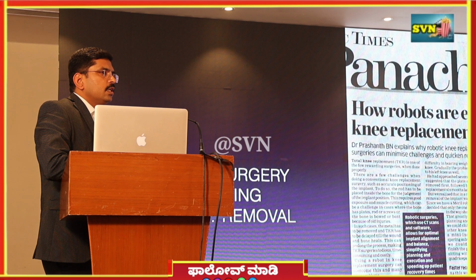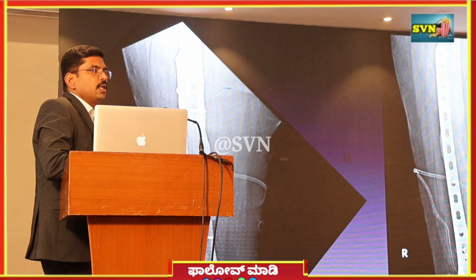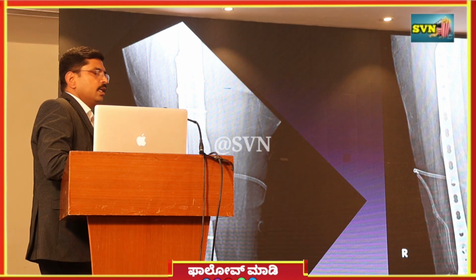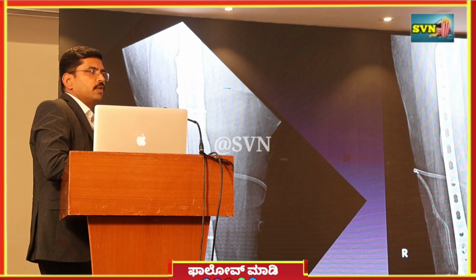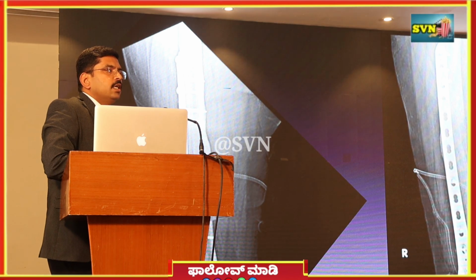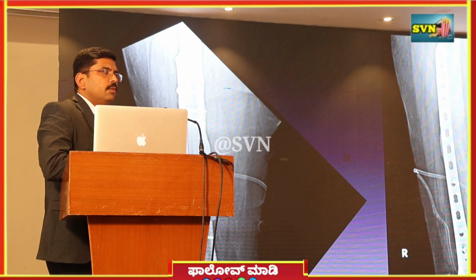So for this patient, post-surgery, this is how his X-ray looks. His implants are in place. Without removing the implant, the knee surgery was done comfortably. And since this was combined with other knee surgery, his pain on both the knees is gone. So his rehabilitation was good and he was walking comfortably.